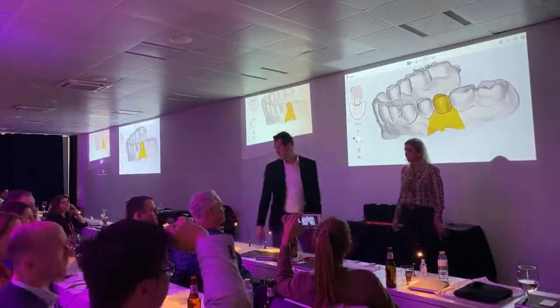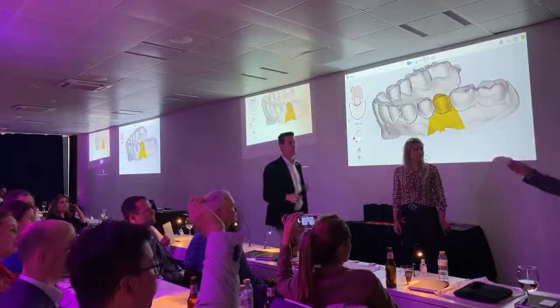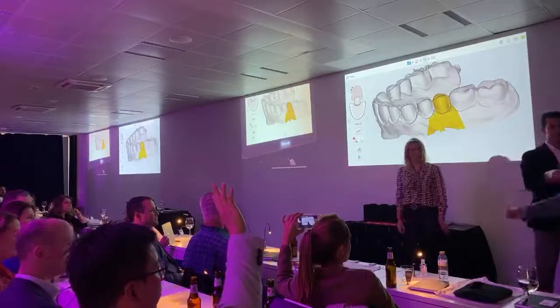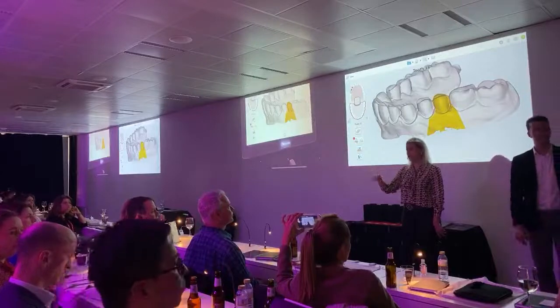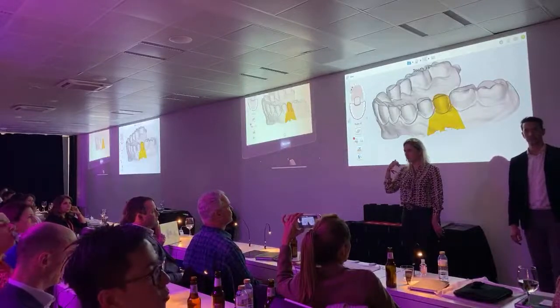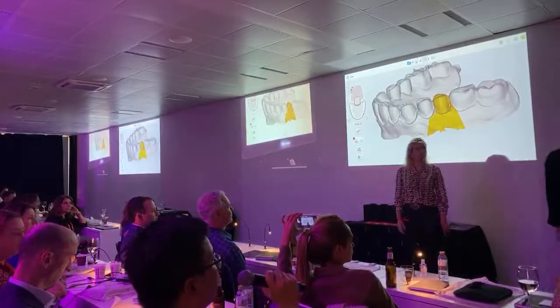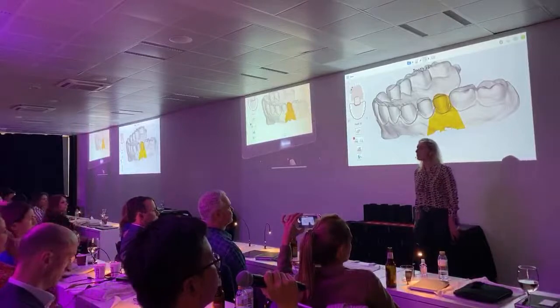With the chairside, same workflow. The only difference is the file doesn't go to your Costa Rica. Yes. You can download immediately and send to them. But you have to activate this option for you, okay? You have to call customer support and ask them to activate the chairside solution. Okay.